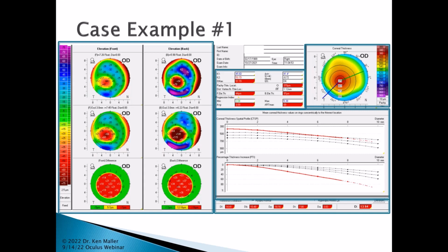Those colors are basically white if it's considered normal, yellow if it's 1.6 standard deviations from the average or equal to that, or red if it's greater than 2.6 standard deviations from the mean. And hence we can see that these are way past what the mean is considered, hence they're in red.